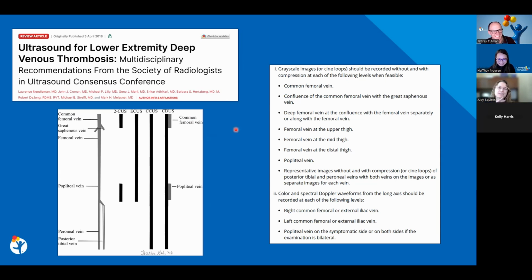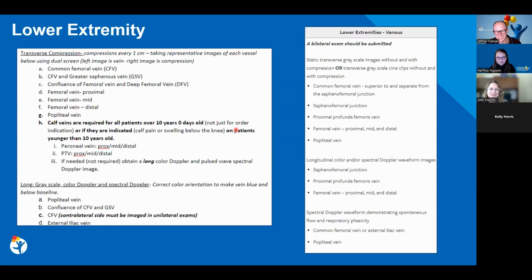Yeah. Obviously, this is not the catheter-associated thrombosis, because that's a little bit of a different story. But when you're just screening otherwise healthy outpatients. Right. Tell us what you find and what we should be doing. Yes, I will. My general indication is that this is probably too young; I think maybe 14 or 15 might be more reasonable. So yeah, we'll revisit that.